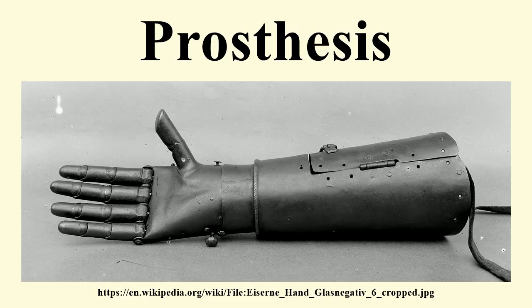In newer and more improved designs, hydraulics, carbon fiber, mechanical linkages, motors, computer microprocessors, and innovative combinations of these technologies are employed to give more control to the user. In the prosthetic industry, a transfemoral prosthetic leg is often referred to as an AK, or above-the-knee prosthesis. A transtibial prosthesis is an artificial limb that replaces a leg missing below the knee. A transtibial amputee is usually able to regain normal movement more readily than someone with a transfemoral amputation, due in large part to retaining the knee, which allows for easier movement.